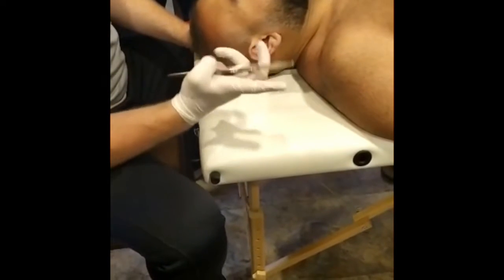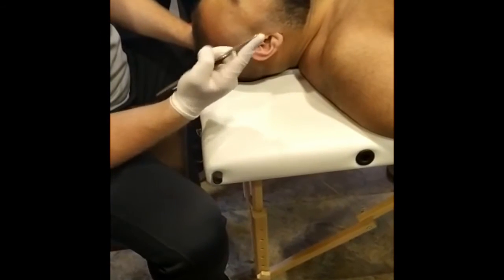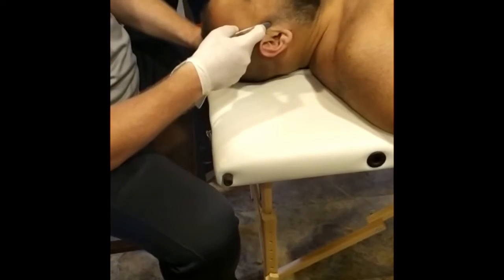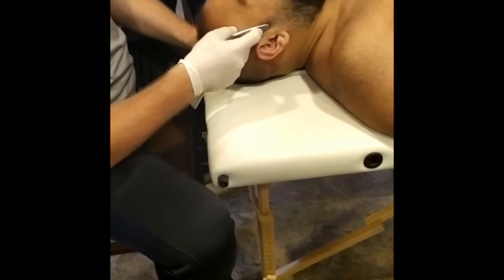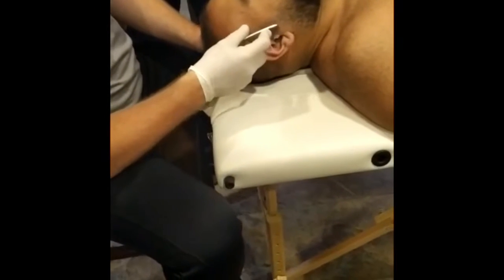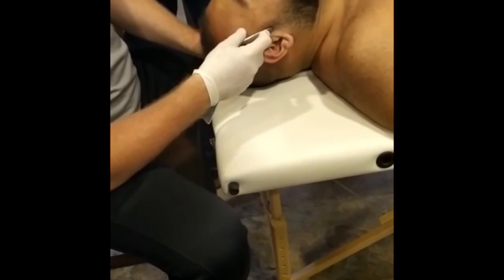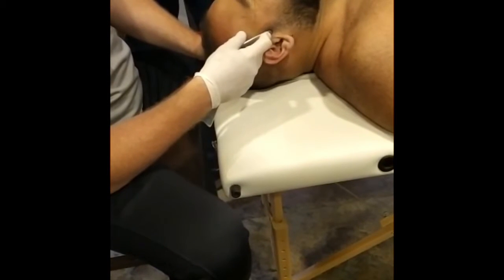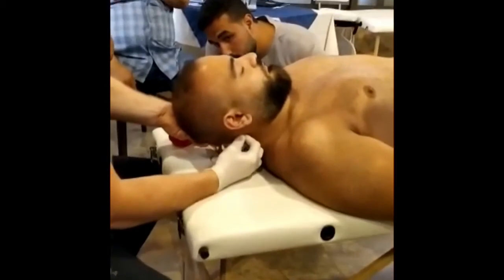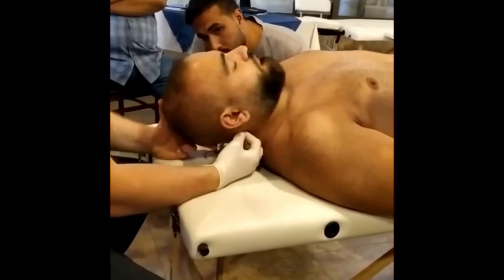To show you guys so you can see, my index finger will not be on top of the number eight. So down, then I'm going to pull up this way. Engage, make sure you have the muscle, drive it up this way, and hold without moving. Dig any point right through here and just let it sink down, relax it a little bit.